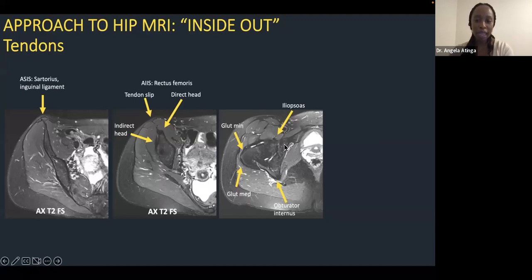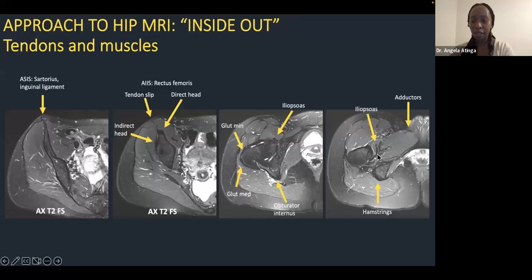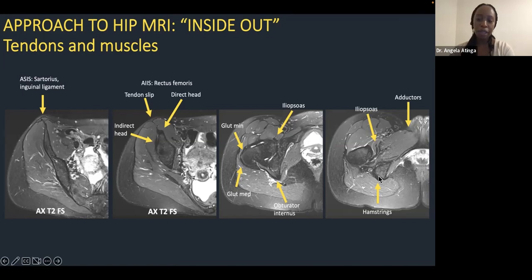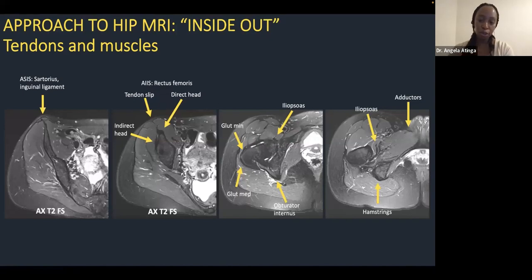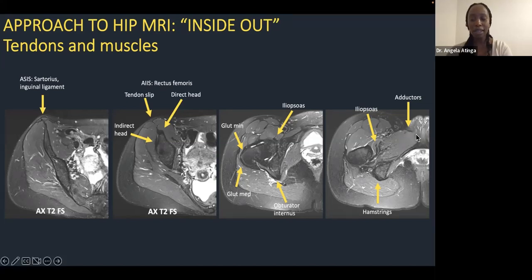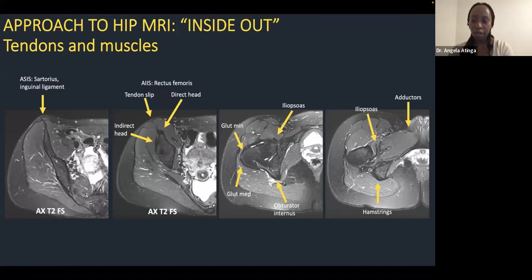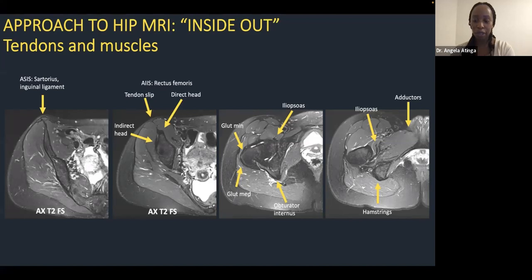At the ischial tuberosity are the common hamstring origins. Medially is the conjoint tendon of semitendinosus and biceps femoris; the lateral attachment is semimembranosus. In the proximal third of the thigh, the tendons rotate so semimembranosus ends up lying medial to biceps femoris. The adductor tendon is also visible anteriorly — you don't see much of it on a hip MRI, but you can look at it on the oblique image. Even without a dedicated athletic pubalgia study, you have at least the ipsilateral hip to look at that tendon.